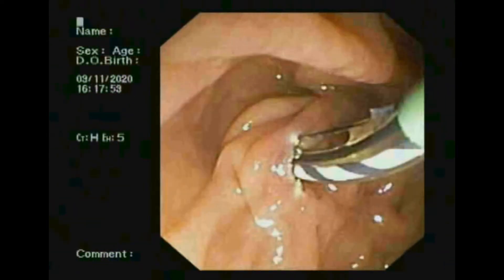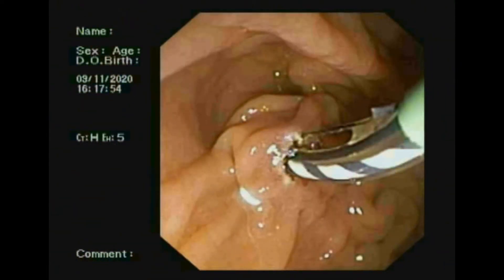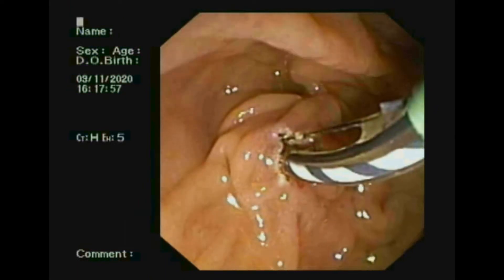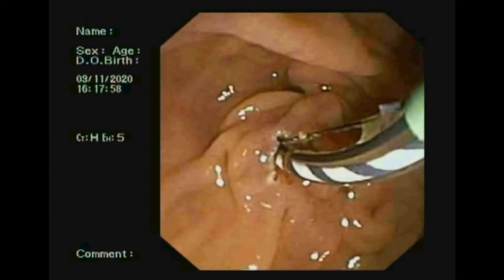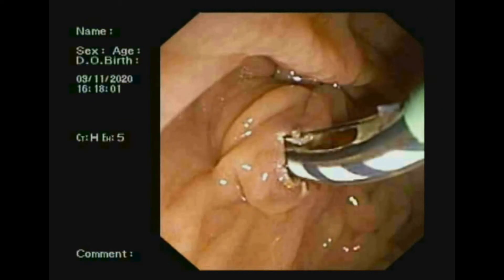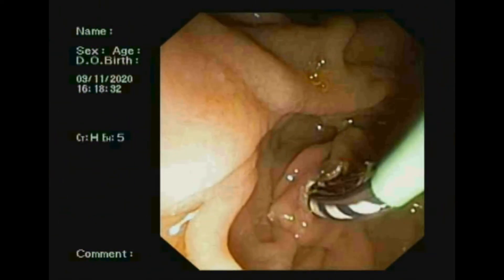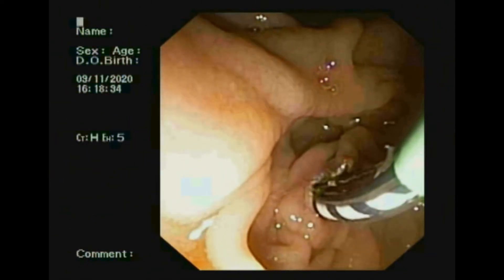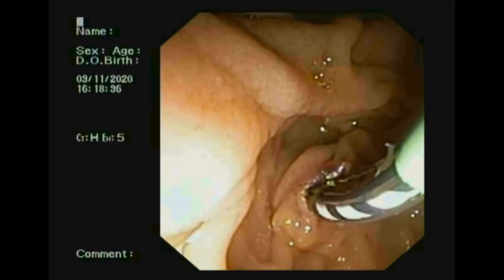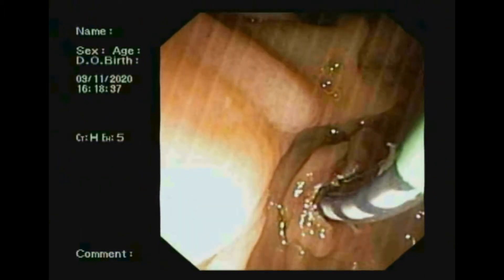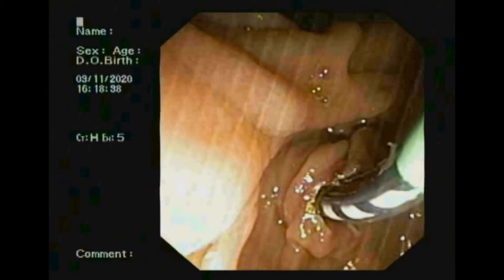Now I am doing sphincterotomy. Sphincterotomy is cutting the muscle that surrounds the opening of the duct or the papilla. This cut is made to enlarge the opening. When the cut is directed towards the bile duct, it is called biliary sphincterotomy. Here I performed a biliary sphincterotomy.